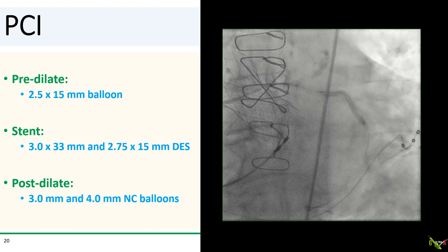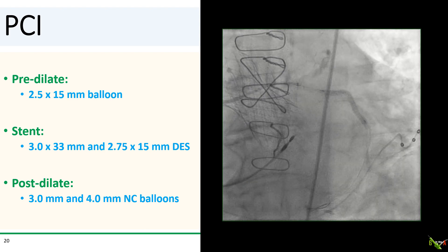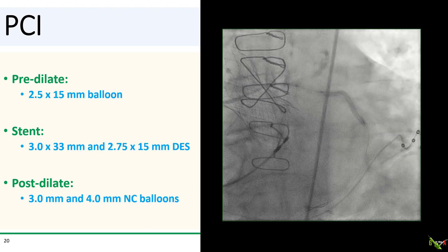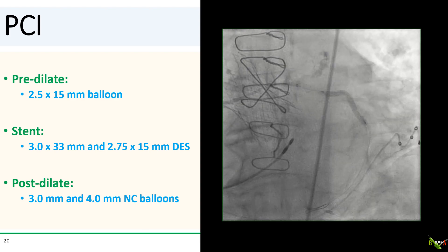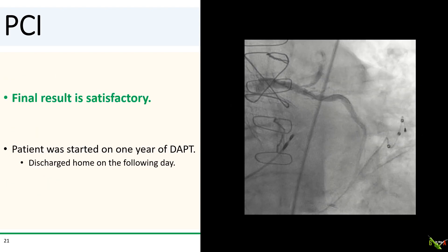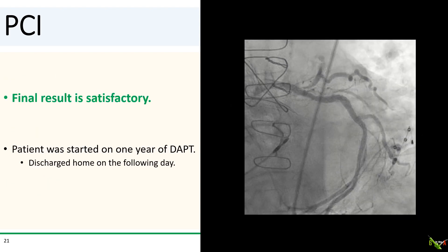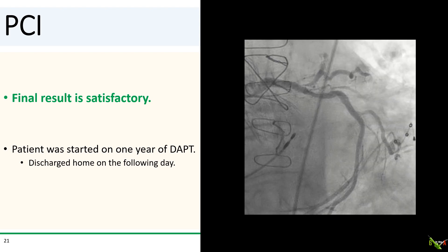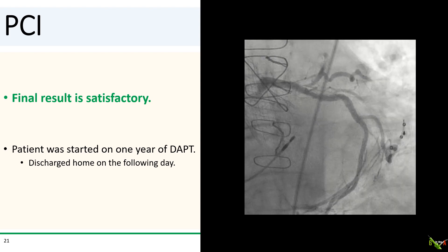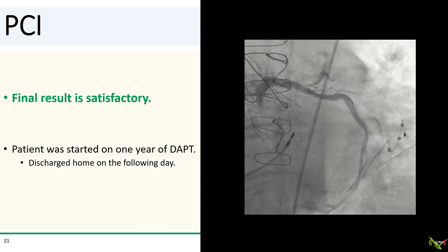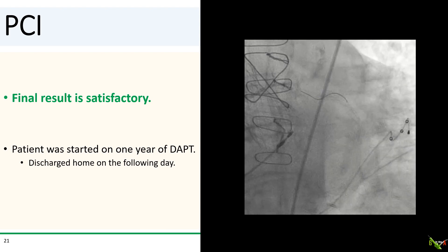We were able to get a 2.5 by 15 mm balloon across the lesion for pre-dilation, and then we stented the circumflex with two overlapping stents and post-dilated with 3.0 and 4.0 mm NC balloons. Here is the final angiographic result, which we thought was quite satisfactory. We started the patient on one year of DAPT and sent him home the following day.